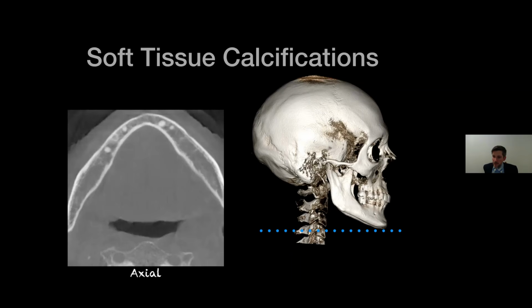Speaking of insurance, if the patient doesn't have coverage for cone beam or the insurance company doesn't recognize it for dental, is there anything that we could do to draw attention to the need for cone beam? Do you recommend billing dental so we could send a message? Since this is a must and can offer radiation levels that are less than pans or intraoral.